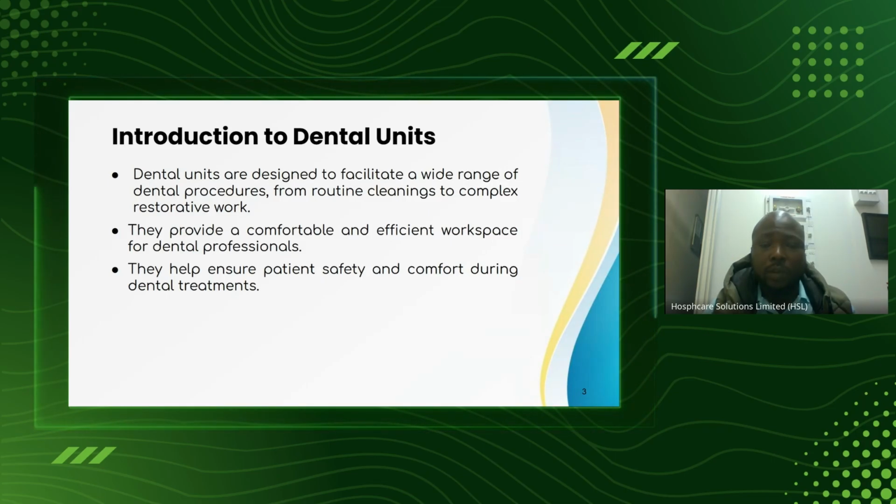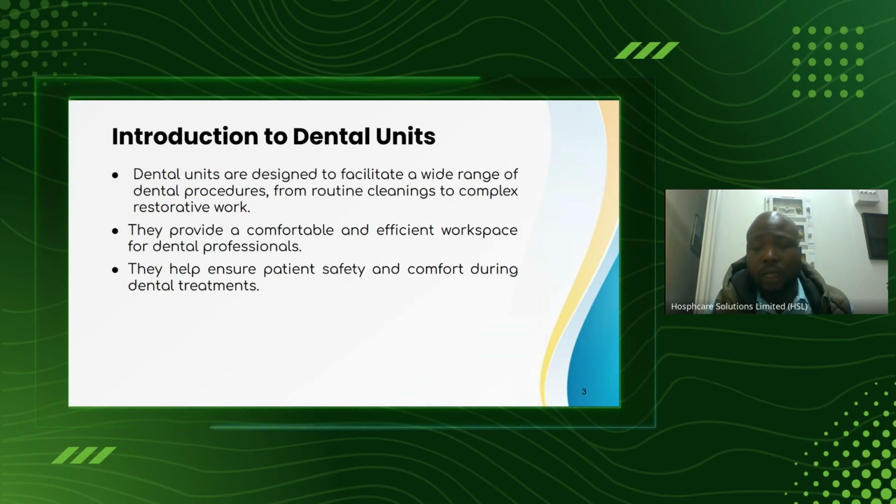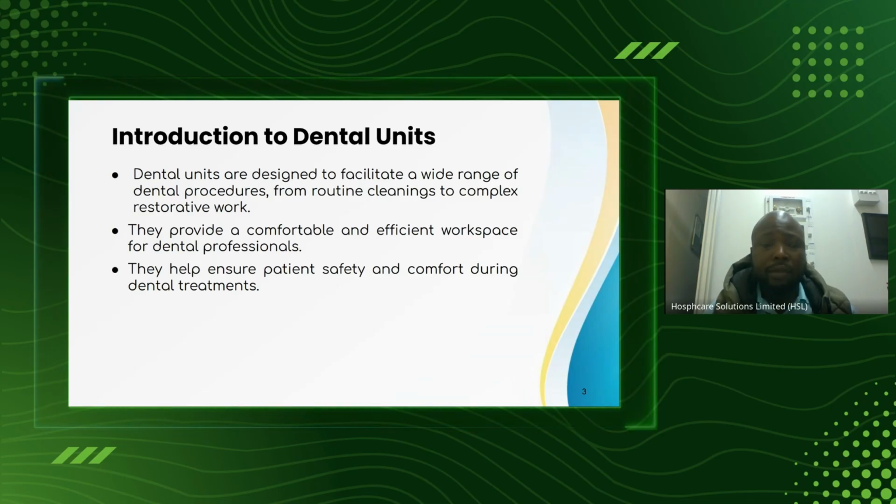The dental unit comprises two items, the dental chair and the delivery, forming a dental unit. The dental unit must provide comfort in terms of the workspace, comfort of the patient and the doctor or the user. It's also supposed to help the patient achieve the medication.